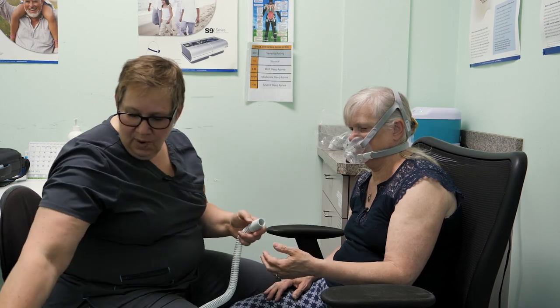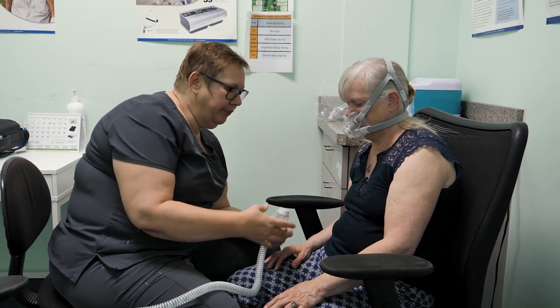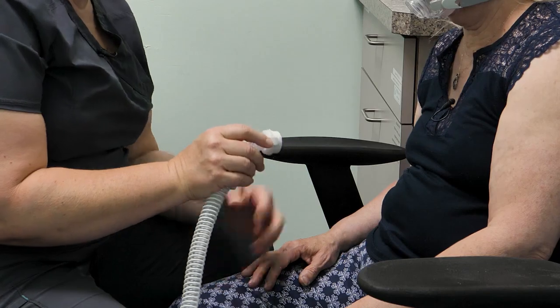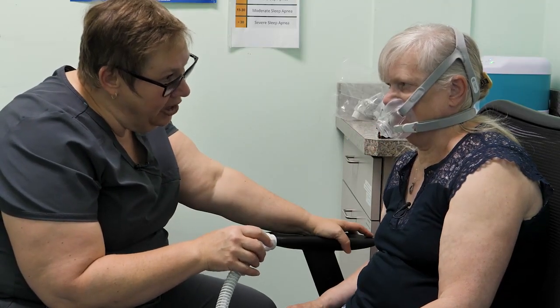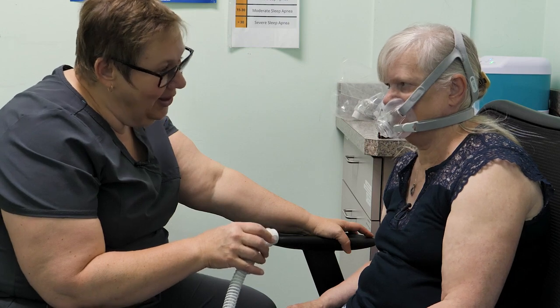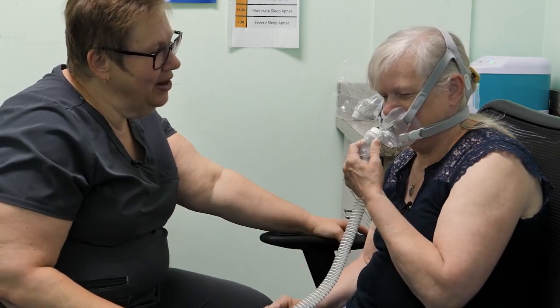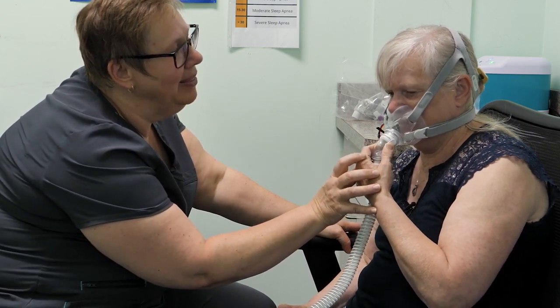Okay, so what we're going to do is we're going to attach this to here. You're going to squeeze this together, and you're going to put it into the hole. So you're going to feel the pressure right away. Are you ready for that? I guess so. Okay, would you like to try and do that now? So just squeeze them together and just put it right in the hole, just down a little bit more, right? There you go.